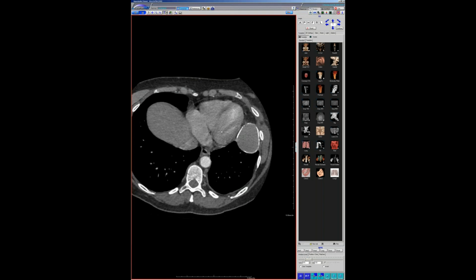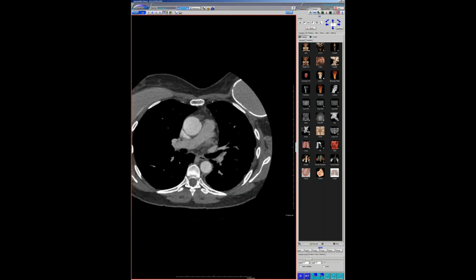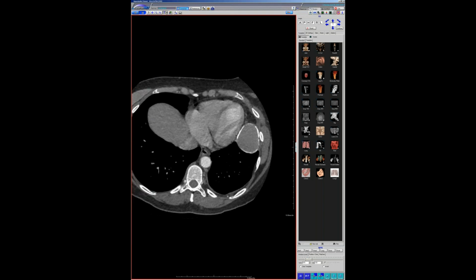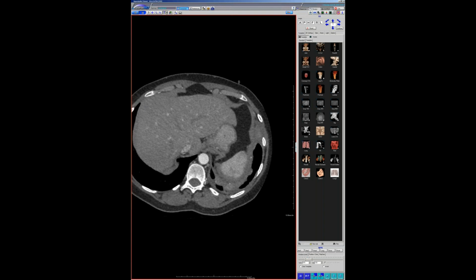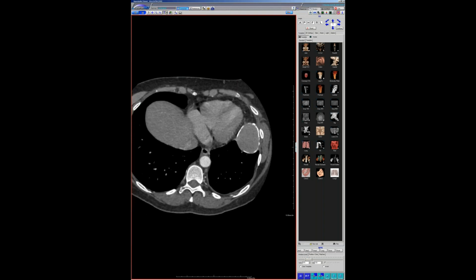And silicone, for some reason, just winds up developing a lot of calcification. But this is intrapleural silicone secondary to some surgical manipulation and breast implant injury. I don't know if other people have seen that before. That was a new one. That's insane. Never seen that before. Never see it again. She's asymptomatic, but they're going to take her to surgery because she wants it out, is what she's telling them. And our surgeons, like many surgeons, are more than happy to oblige.